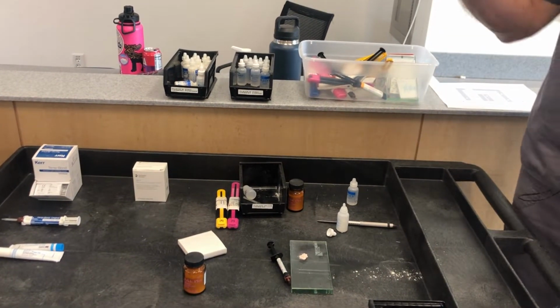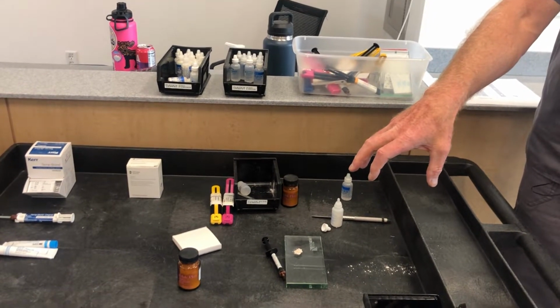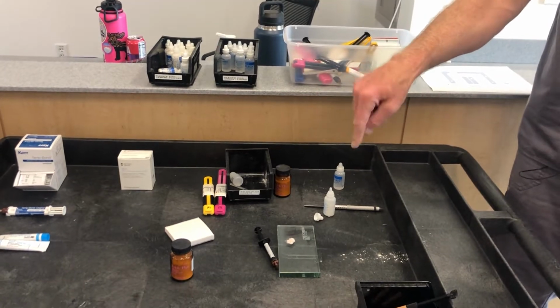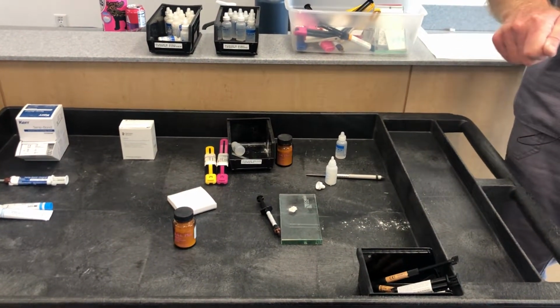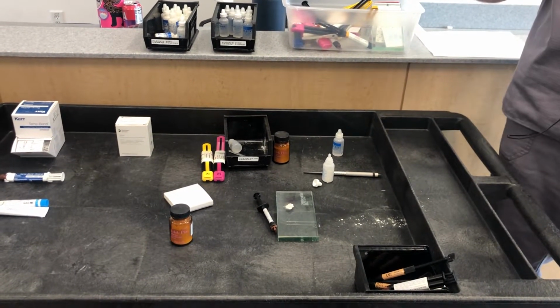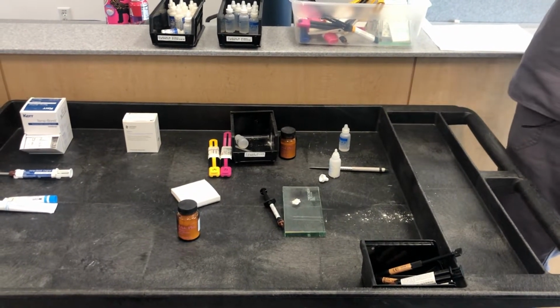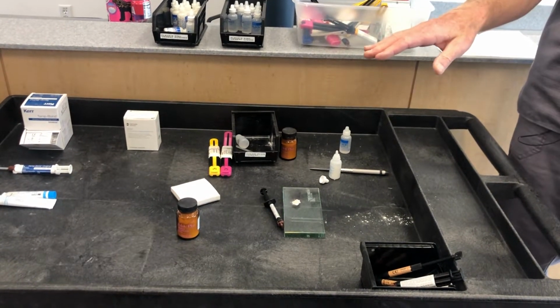So when you take the temporary off, where's the cement? It's on the tooth. And so you have to plan on getting that off, and it's a bugger to scrape off with like a scaler, but with a sonic or ultrasonic scaler, you can pop it off in no time at all and get it off the tooth structure. But that's a great question, and so you've got to be careful when you use it.